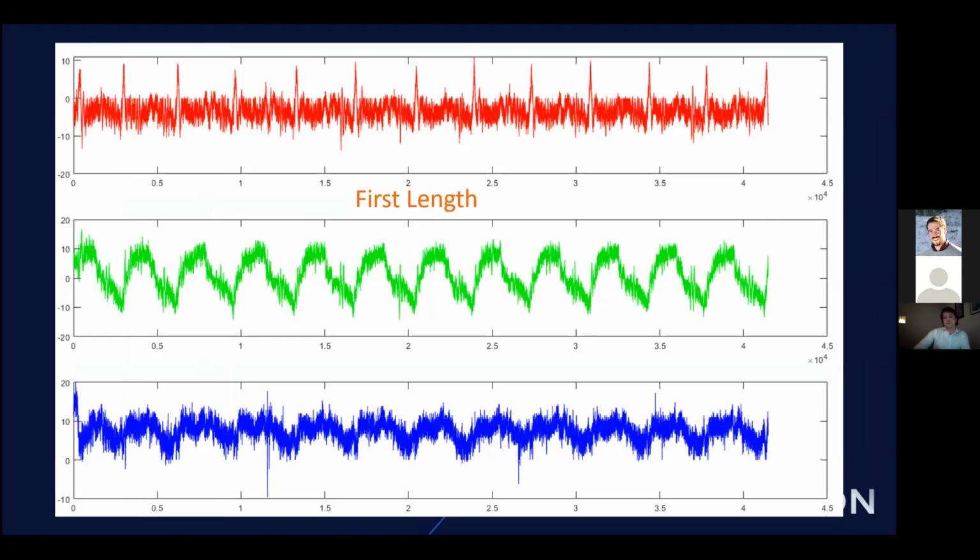When the swimmer then emerges and begins to swim in freestyle, we can see the left and right strokes in the y-axis. So the positive accelerometer values here indicate a clockwise rotation of the pelvis in the transverse plane. And likewise, the negative values indicate the anti-clockwise rotation.